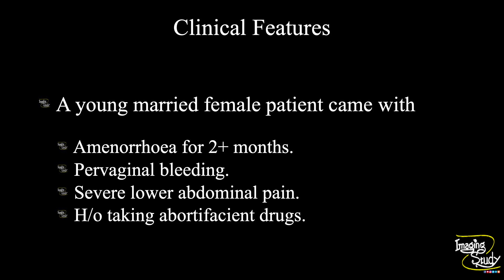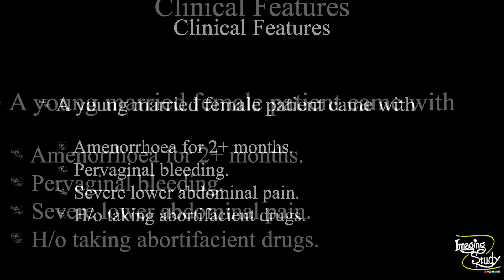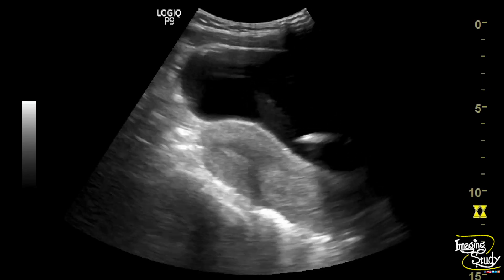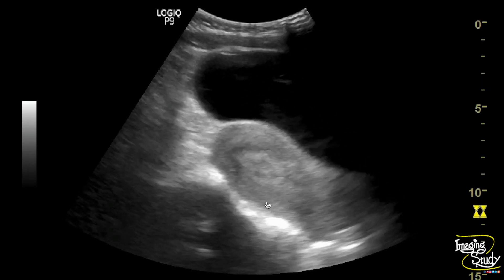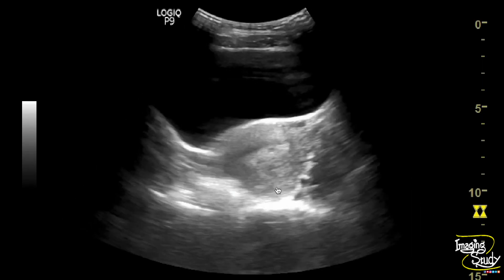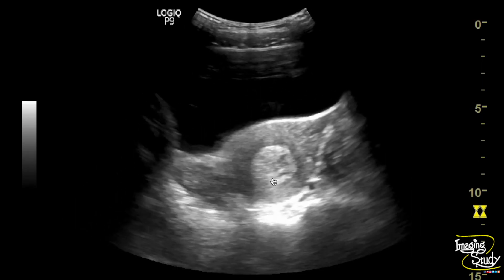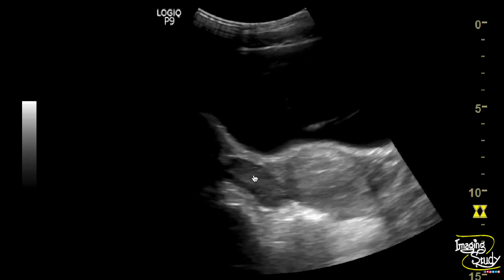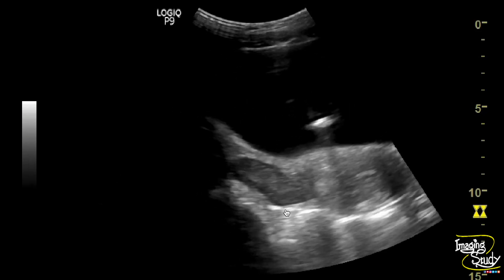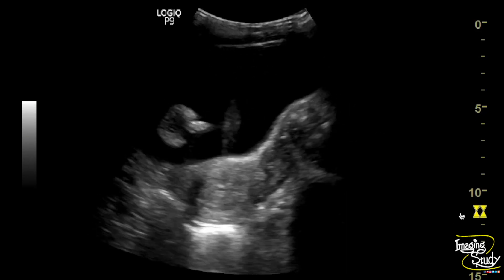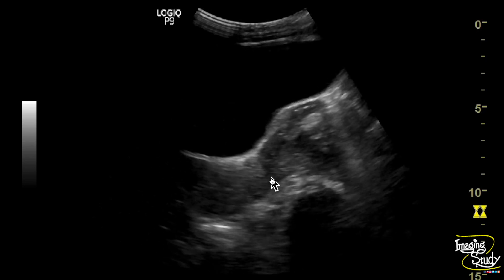Let's see what we have got on ultrasound. Here you can see the longitudinal section of the uterus. You can see some irregular heterogeneous substance noted within the uterine cavity, both in longitudinal and transverse sections. This is the right ovary and this is the left one.